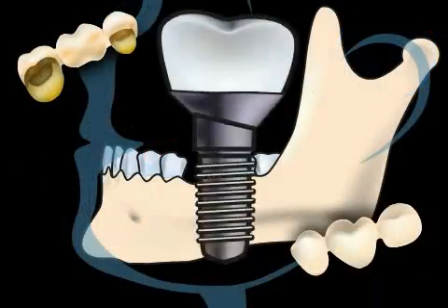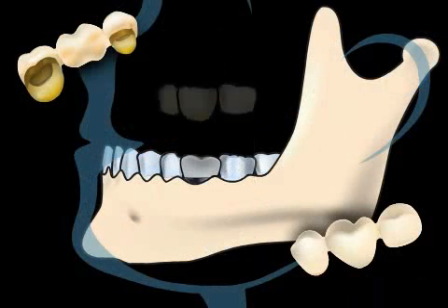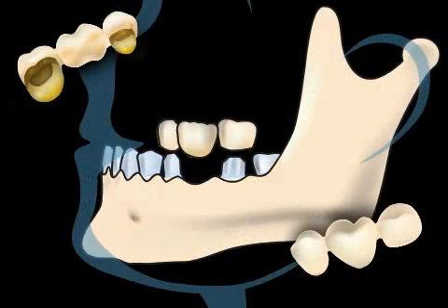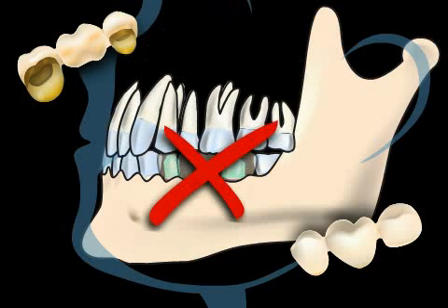More and more, the trend is towards creating realistic reconstructions. Thus, gaps in the teeth are more and more frequently closed with artificial dental roots, or implants. A blocking of teeth, as in the classic bridge, is less and less necessary.